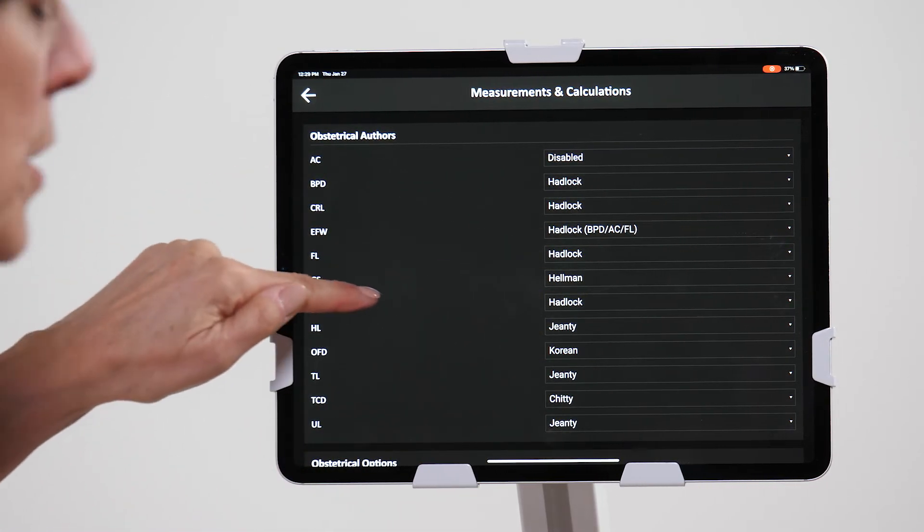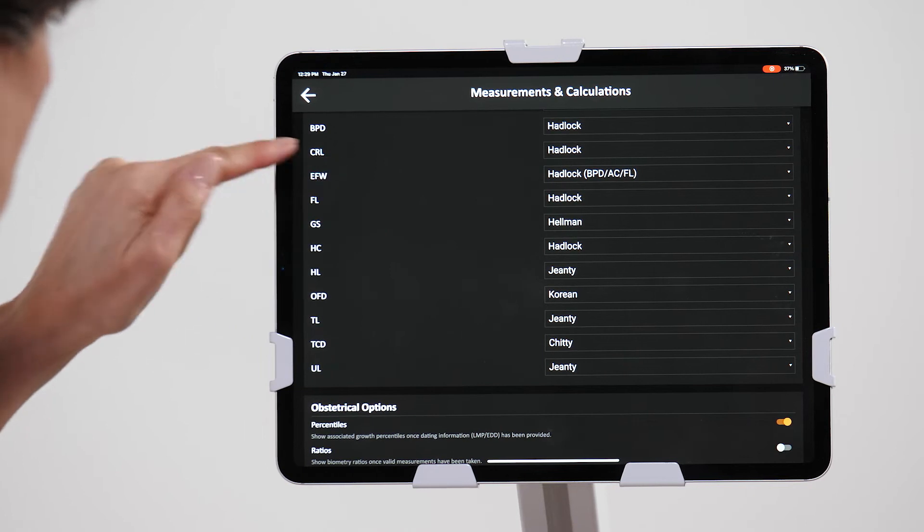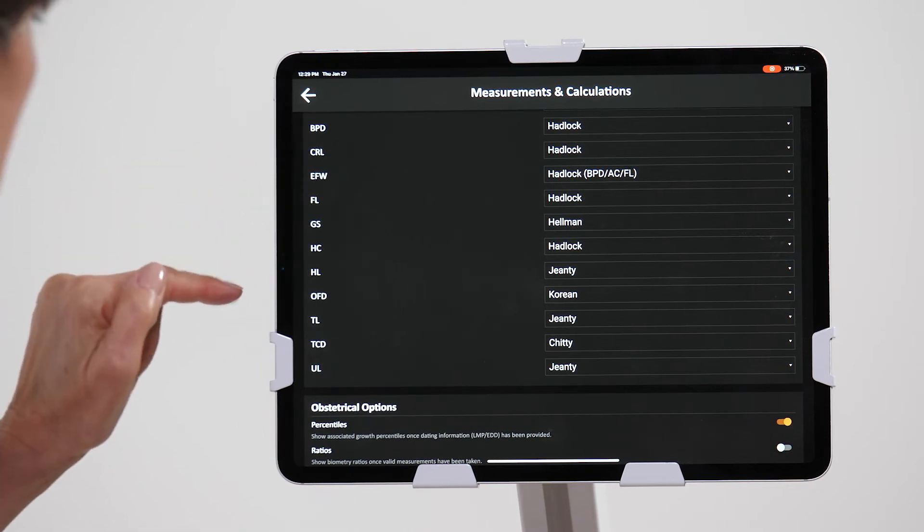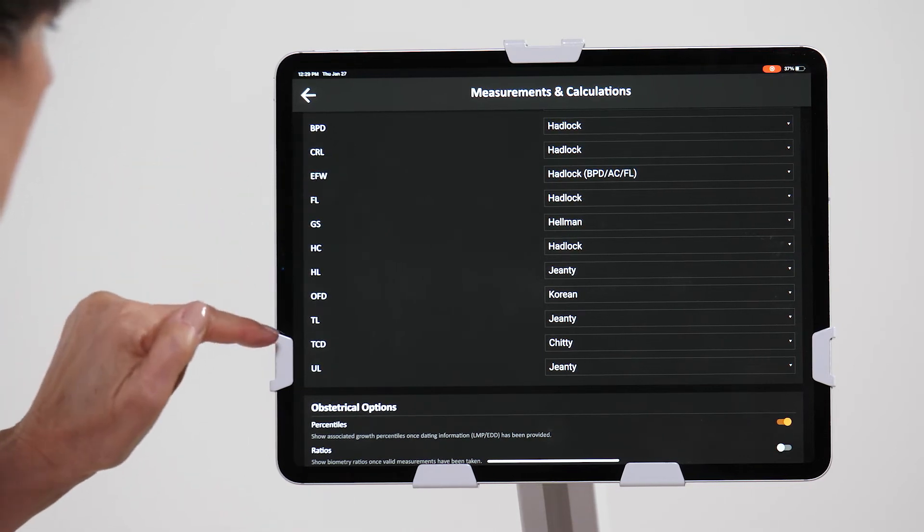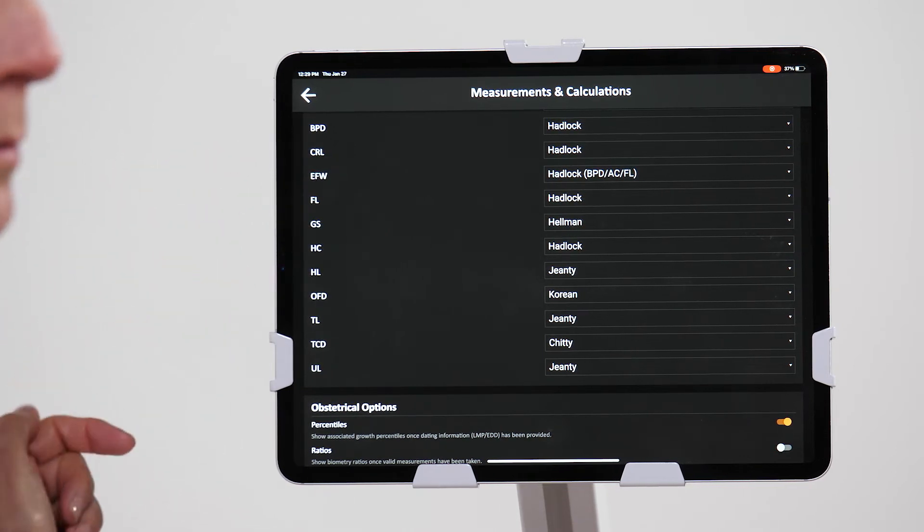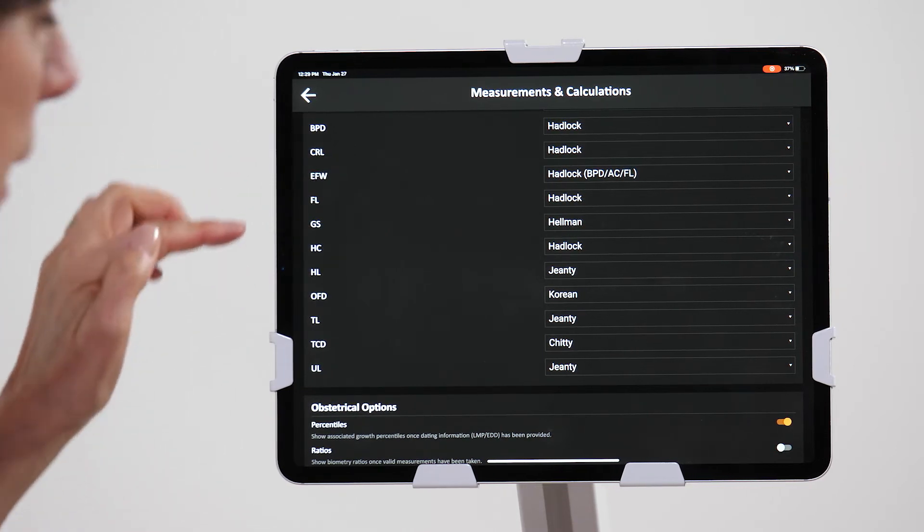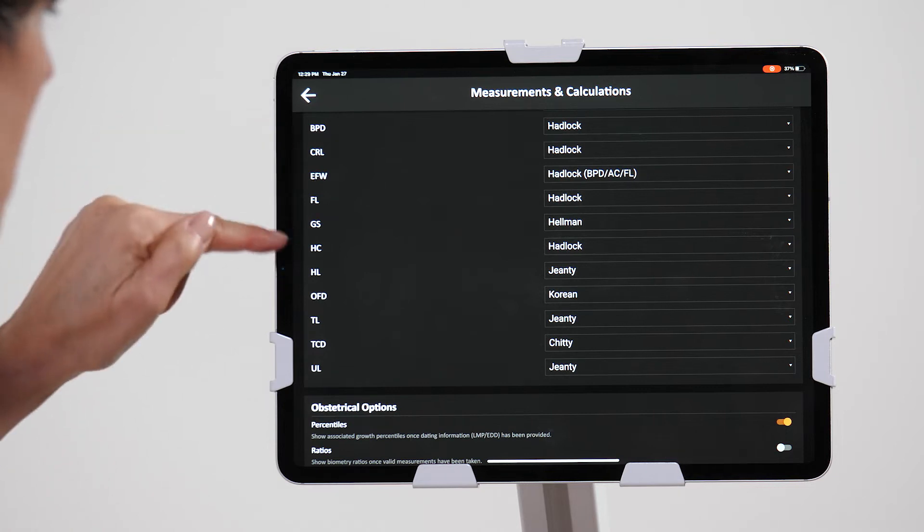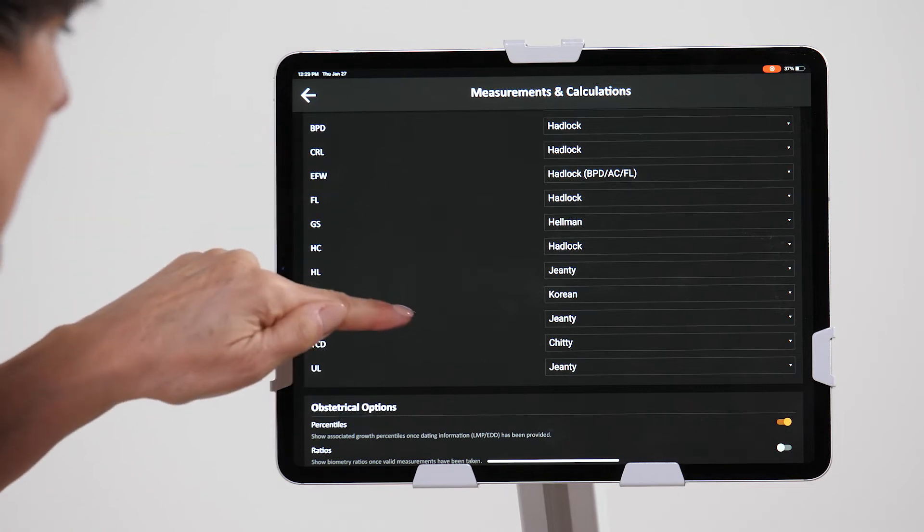We've also added a few more measurements like OFD, TCD, ulnar length, humeral length, etc.